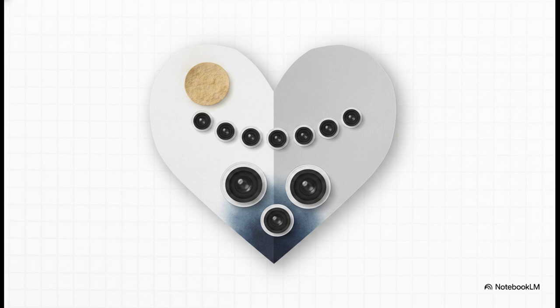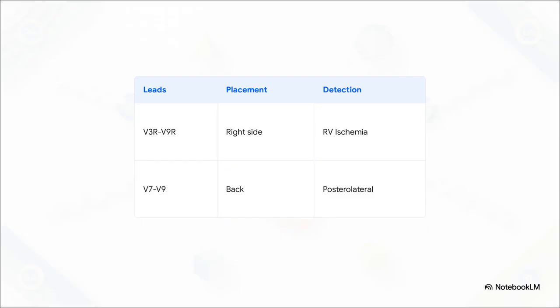Same thing for anterior ischemia. Damage to the front of the heart uniquely shows up in precordial leads V1 through V6, plus leads I and AVL. But look, sometimes the standard 12 cameras just don't cut it. We have blind spots. So when we suspect hidden damage, we just bring in supplemental leads. We can use right-sided leads, literally moving cameras to the right side of the chest to catch right ventricular ischemia. Or if we're chasing an acute posterolateral infarction that's hiding in the shadows, we slap posterior leads right on the patient's back. We basically just keep adding cameras to our studio until we capture the exact pathology we're looking for.